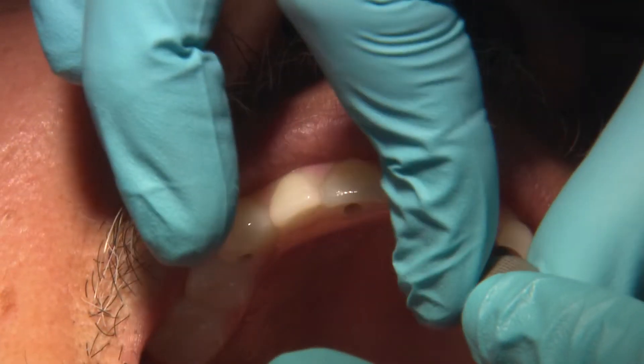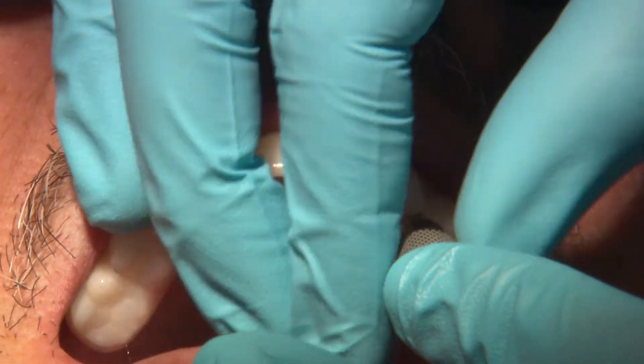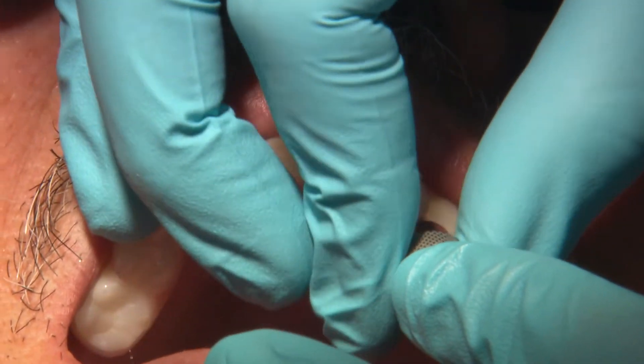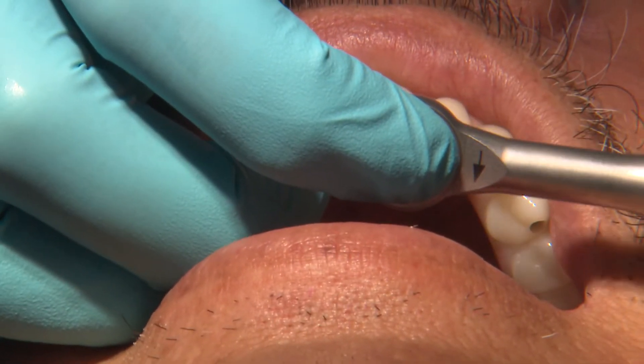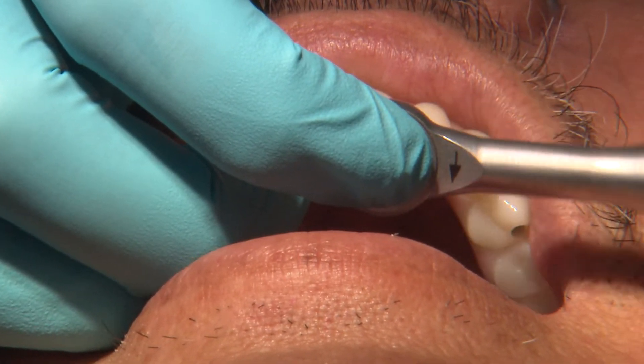Once each screw is lightly hand-tightened, I then go back with my torque wrench and tighten each screw to the manufacturer's recommendation. For the Hahn MUA prosthetic screws, we are tightening them to 15 newton centimeters.